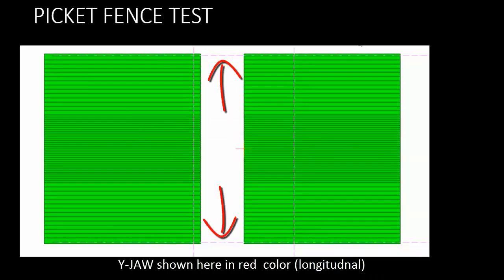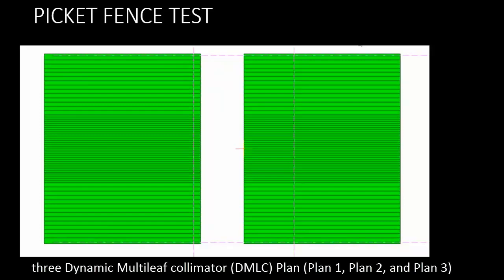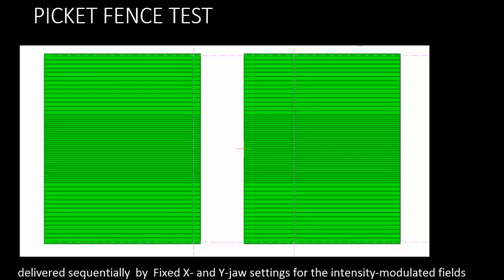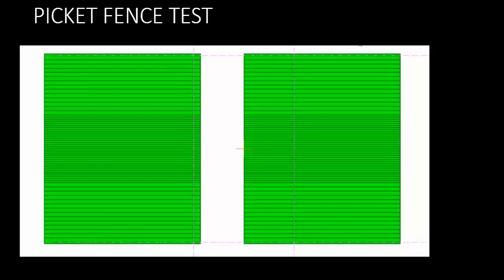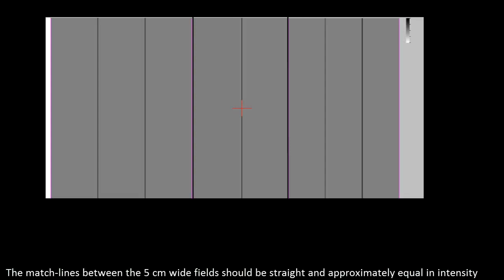The Y jaw shown here in red color moves in the longitudinal direction. For film exposure, three dynamic multi-leaf collimator (DMLC) plans — plan 1, plan 2, and plan 3 — are delivered sequentially by fixed X and Y jaw settings for the intensity modulated fields and monitor unit settings. You can examine the match line between the 5 centimeter wide fields to detect displacement in leaf position.